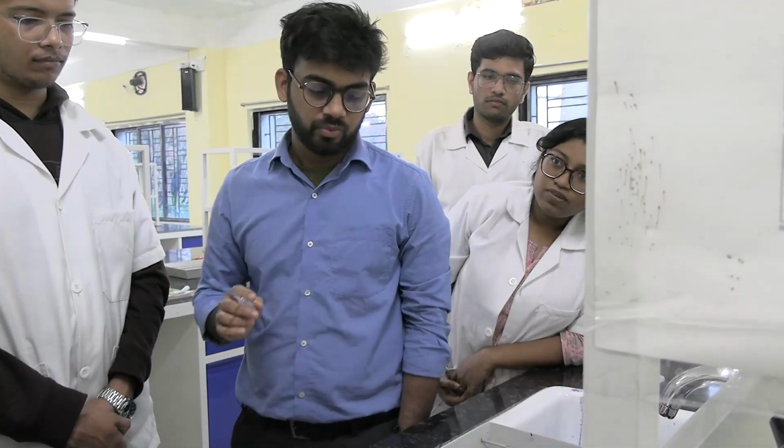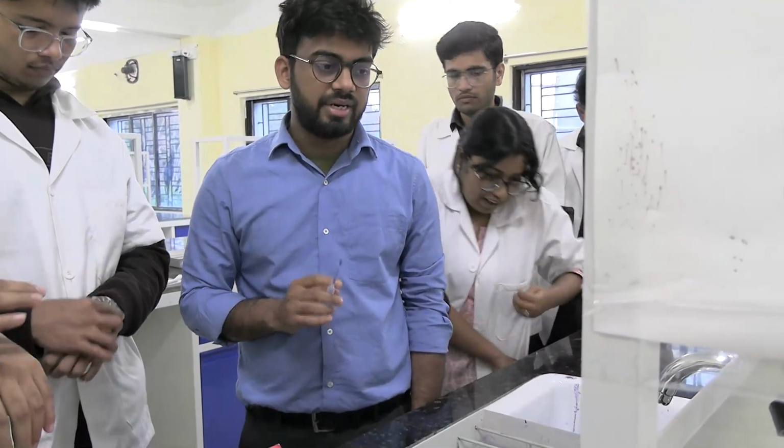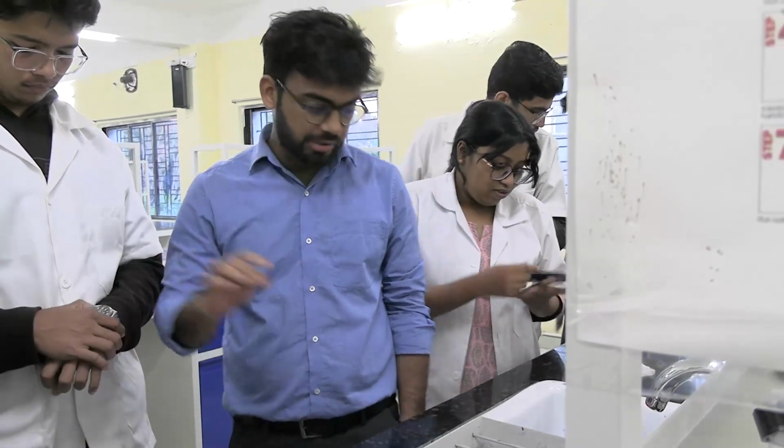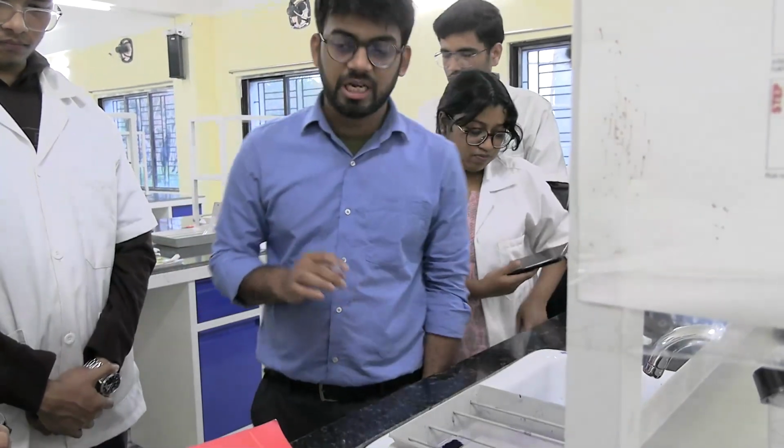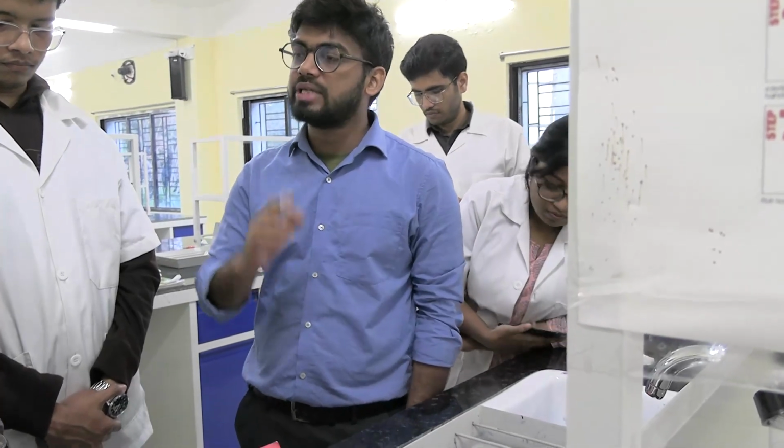Have you seen the time? It is already 15 seconds past. Okay, count that. Tell me when it's 2 minutes. In 2 minutes, I am going to say why we use acetone-free methyl alcohol. You have studied this in class today, right? Why should it be acetone-free?